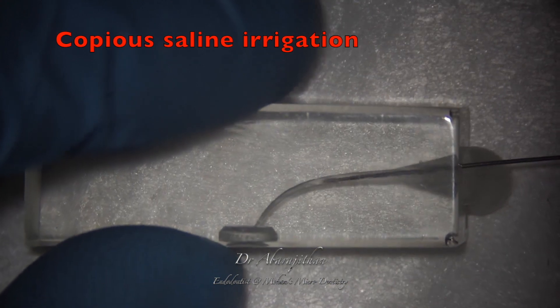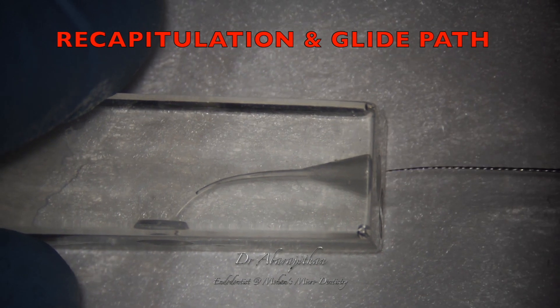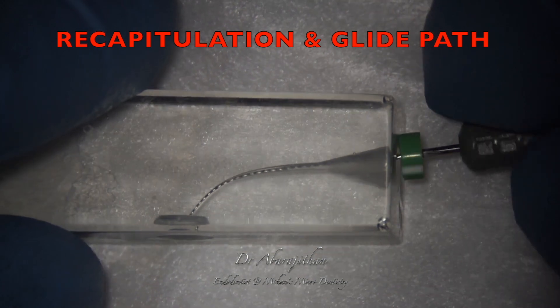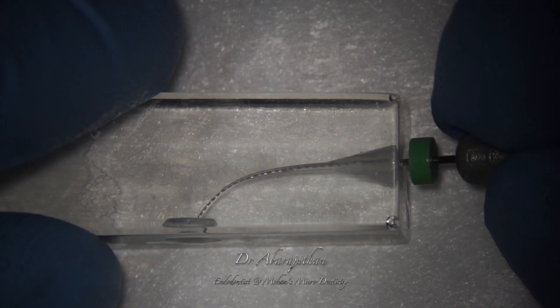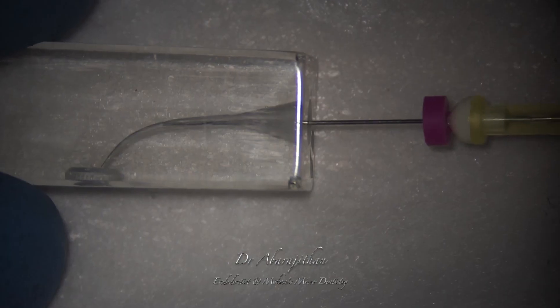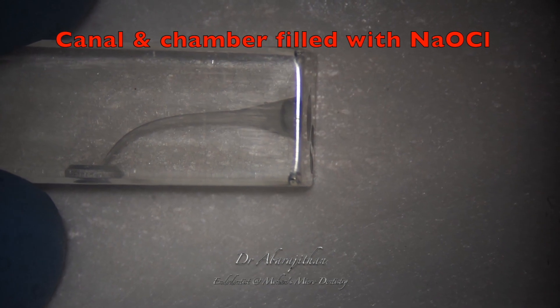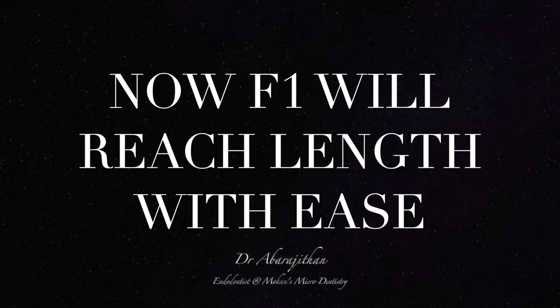We follow the standard protocol of copious irrigation after every rotary instrumentation, recapitulation with the 8 size K file, and glide path verification. We again repeat the step of filling the entire canal and pulp chamber with 5.25% sodium hypochlorite. Now F1 will be used to working length. Since the S1 has already been used here, F1 will find its way much easier to the apex.